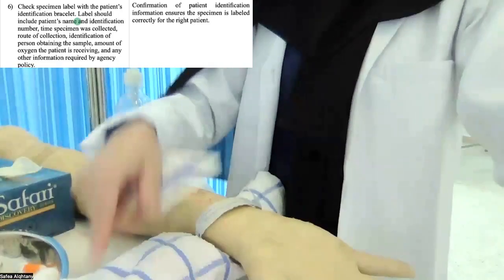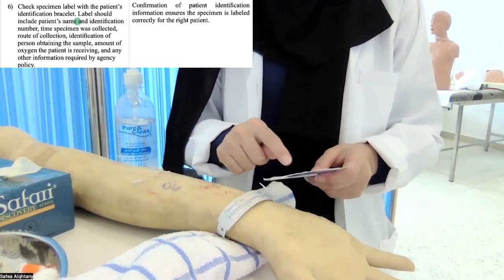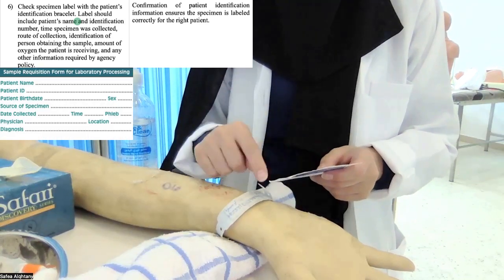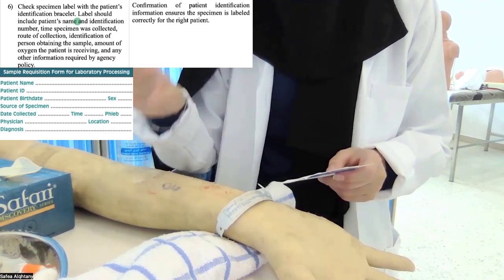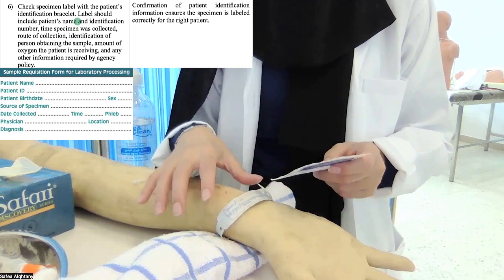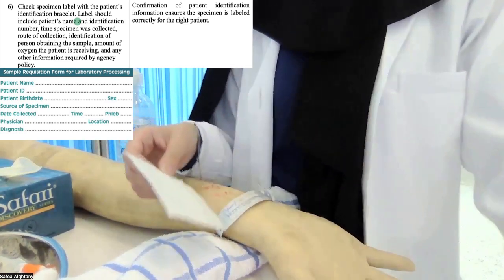كاملة with the patient bracelet. طبعا البيشنت يكون عنده bracelet. I need to check the patient's name and the ID number to make sure they are matching. I need to check the time that the sample was obtained. I need to check also whether the patient is on an oxygen source and how much the patient is receiving.